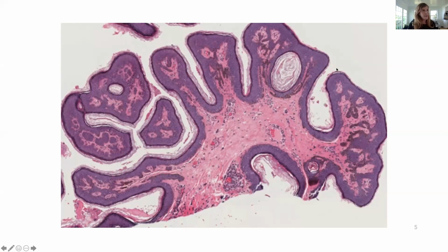This epithelium is thickened, and you can see that the rete pegs, the normal little pegs that help hold the epithelium on the dermis, seem to be bridging. So here you can see some bridging, and then you can see some basal cell layer pigmentation here, and that's what gives these the color.